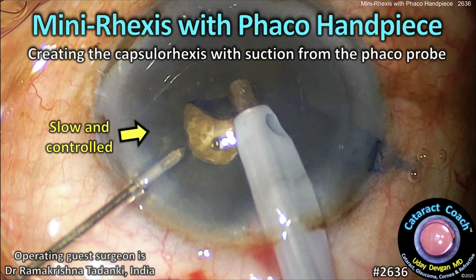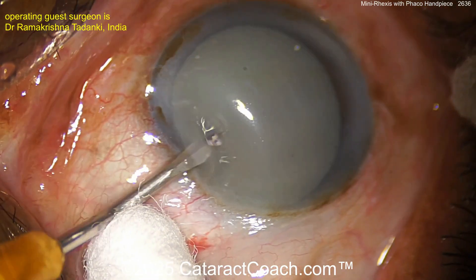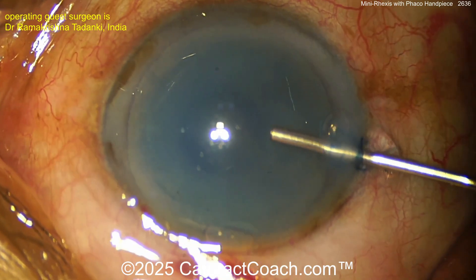From cataractcoach.com: mini-rexus with the phaco handpiece, creating a capsulorrhexis using just the suction from the phaco probe. Here we have an intumescent white cataract — trypan blue dye has been applied. The video is sped up for efficiency, and now viscoelastic is being placed inside the eye.